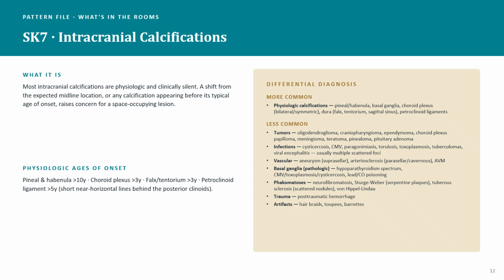So again, when they're seeing calcium inside of the skull, it doesn't automatically mean that something's wrong, but they do pair it with things such as the patient's age, the pattern, and also the location.